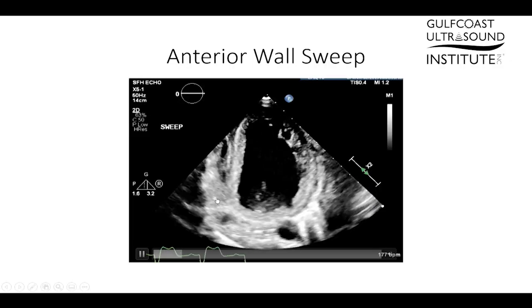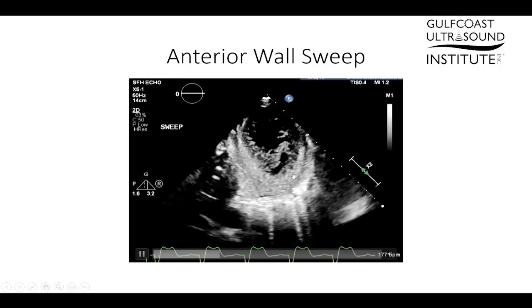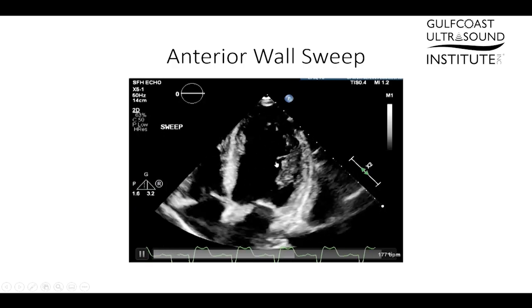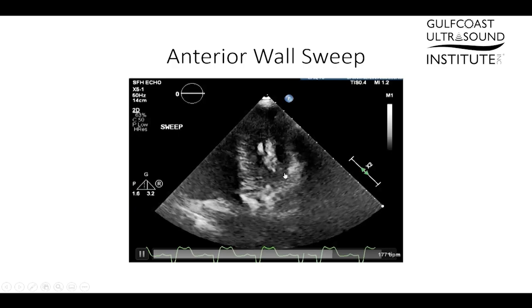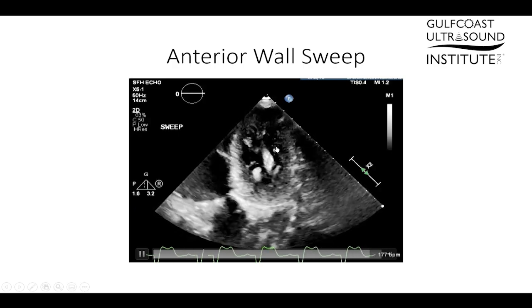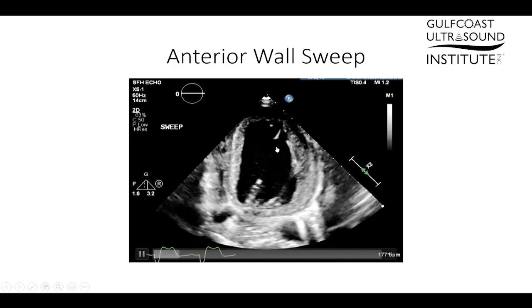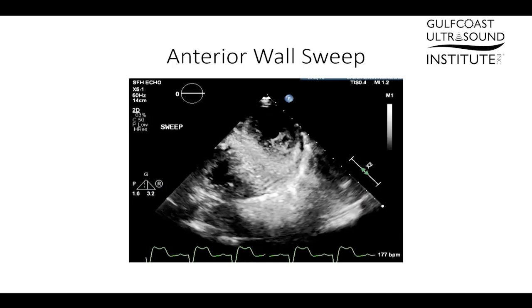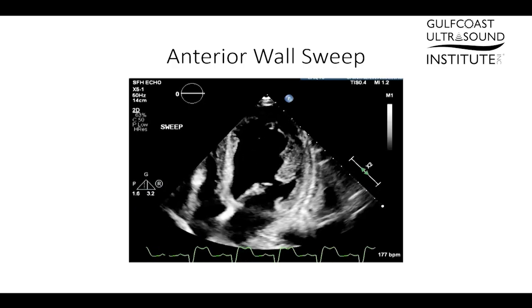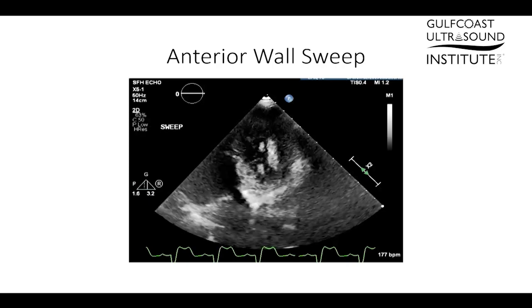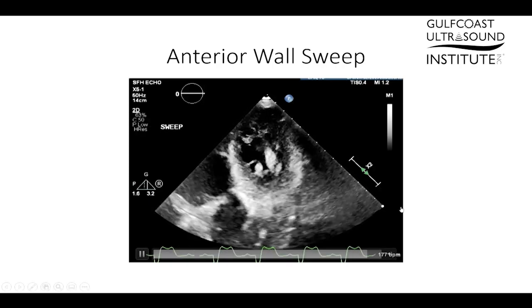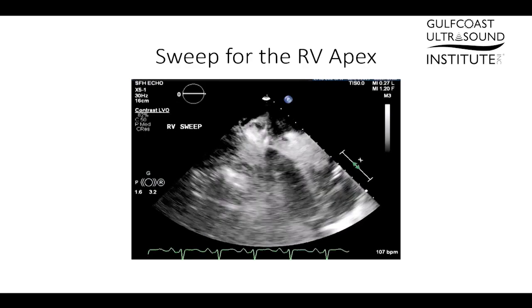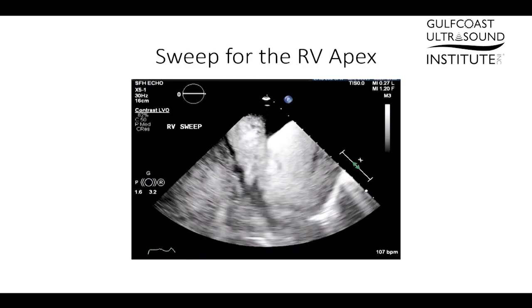Here we have another posterior sweep looking all the way down at the apex, and notice as we come back and look anterior there is a thrombus on the anterior wall. This is a good example of the importance of doing that posterior sweep, but we also want to look anterior as well.